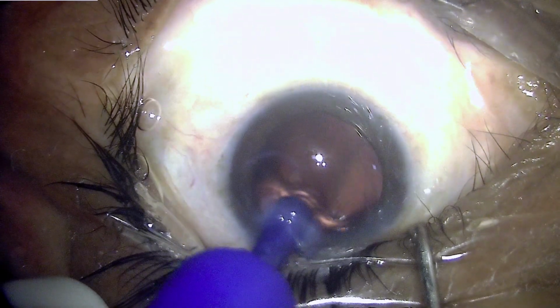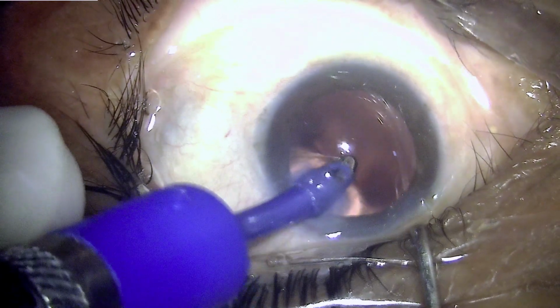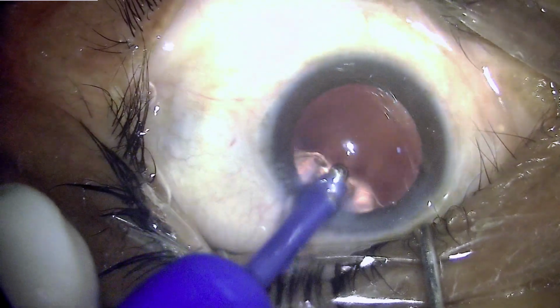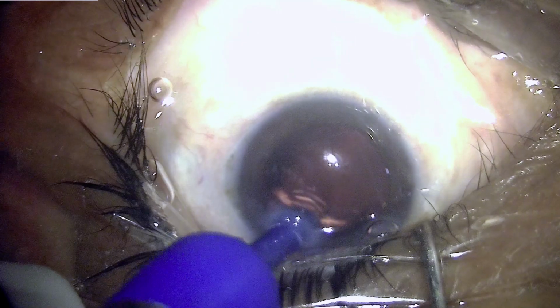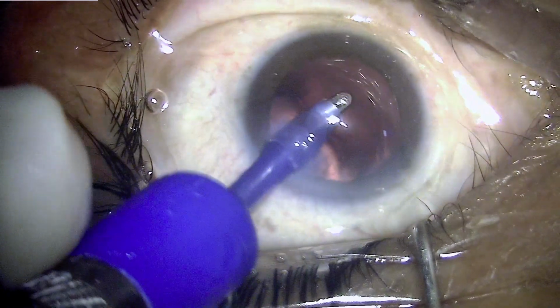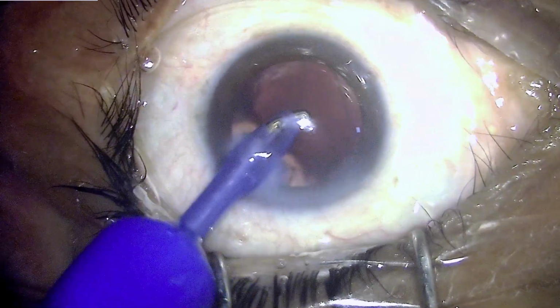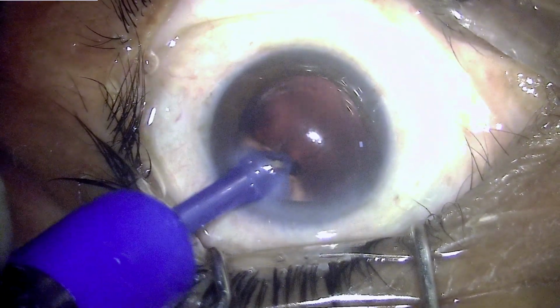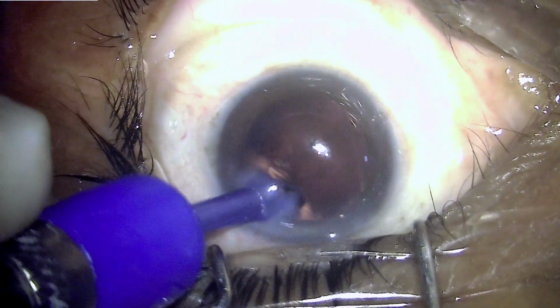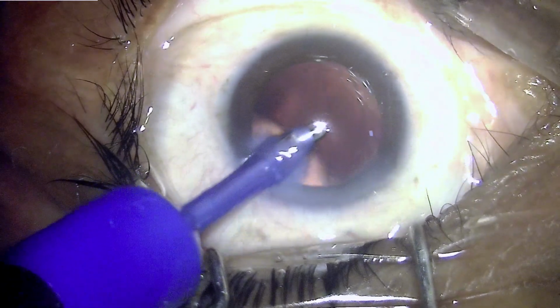Trying to remove the subincisional area, which in spite of being engaged is not coming out easily, is a situation where one has to take conscious decisions so as not to increase the amount of damage, and at the same time also finish the surgery so that it is picture perfect.